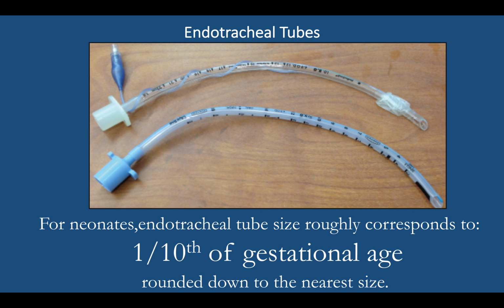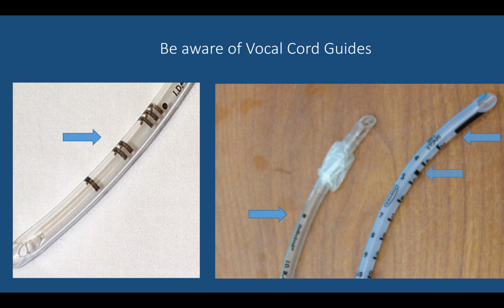On your tracheal tube, you'll also notice hash marks. There are different types of endotracheal tubes, and we cannot predict what we may have when you're watching this video. On the left, you see 3 hash marks. Aim for the middle one.